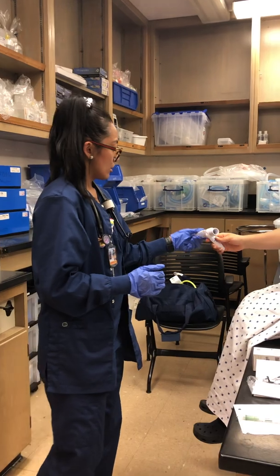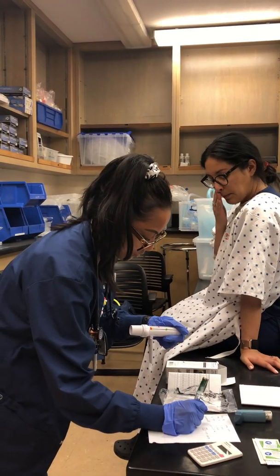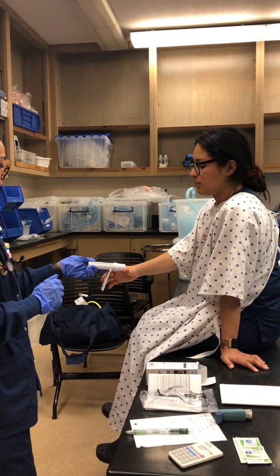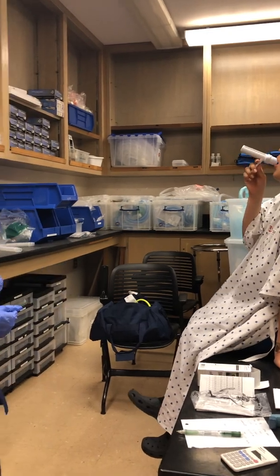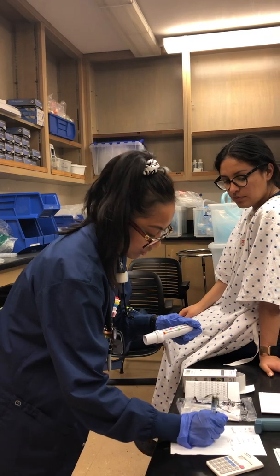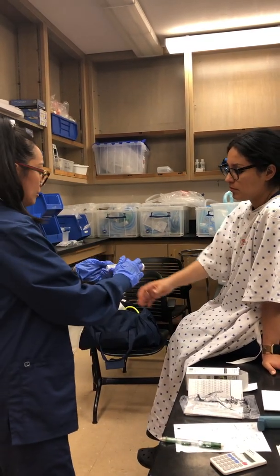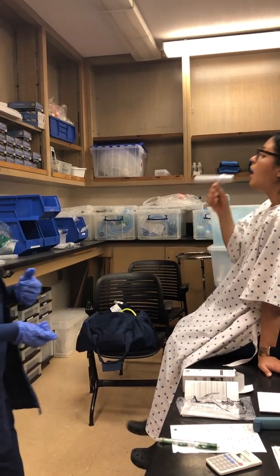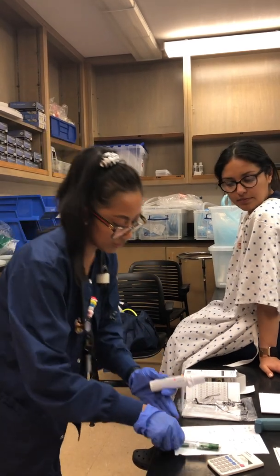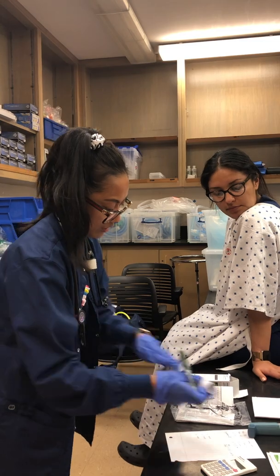Okay. So we got up to 300 for your first one. Okay, gonna reset that and go ahead again. I got 305. Okay, try one more time. I'm gonna go ahead and reset that for you. Okay, so for this one we got 320. Okay, so reset this.